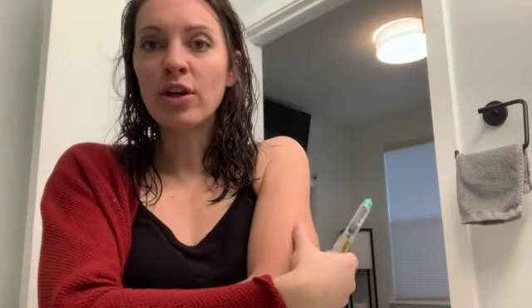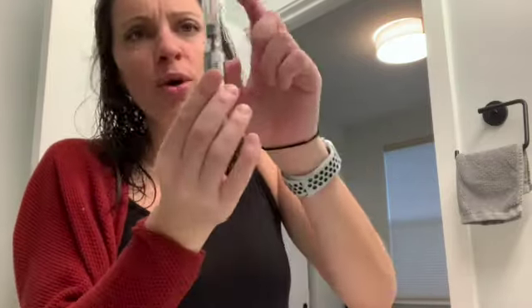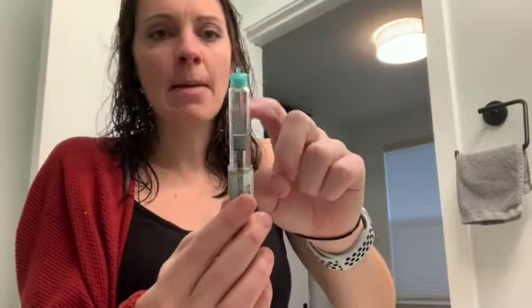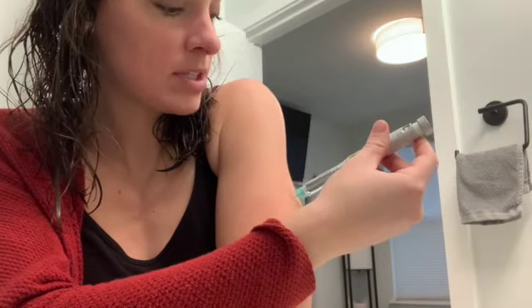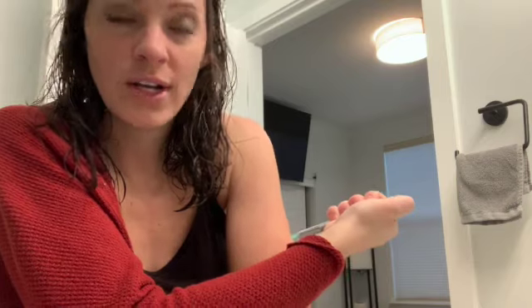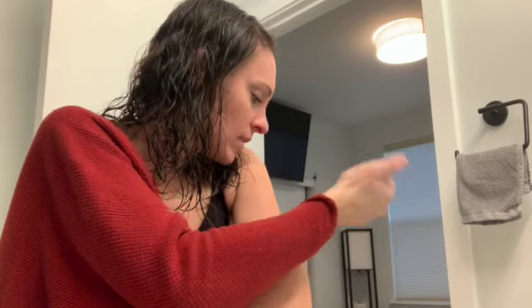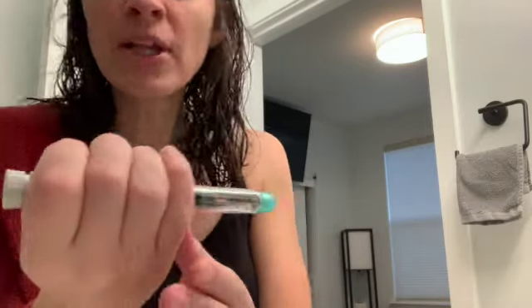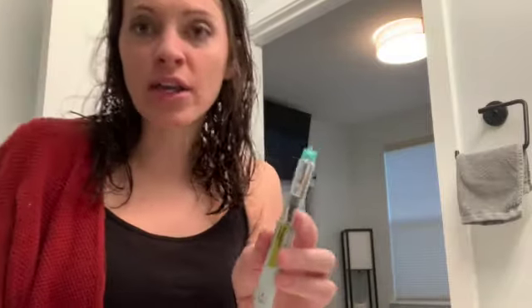There's a trick where you can push your arm up against something to make it a little bit easier, but for the video I'll show you directly. You also want to make sure the bubbles are out — tap it a little bit before putting it in your arm to make sure all eight units get in. I'm just going to put it in my arm. It's in, and I push and got all eight units. I usually hold it there for about 10 seconds just to make sure it all goes in.